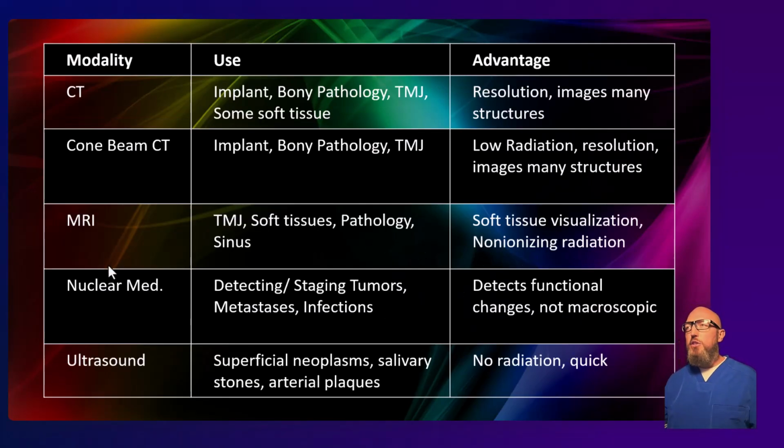All right, and then this chart sums it up. I don't expect my students to memorize everything here, but this is just kind of a good summary of when these different modalities are used, the advantages compared to others. And I really think for general dentists, if you can't remember all of these, that's probably okay. We're not the ones taking these, right?